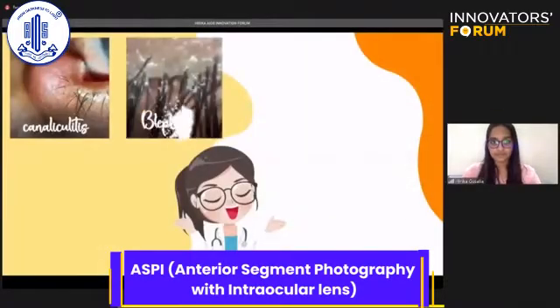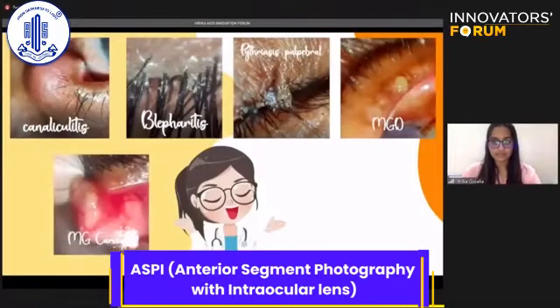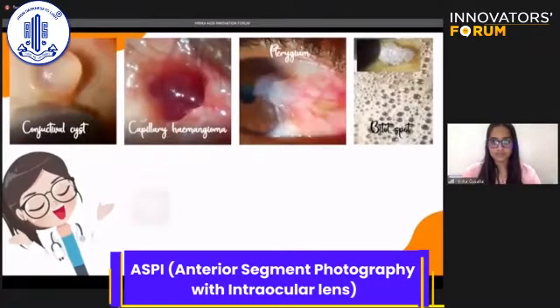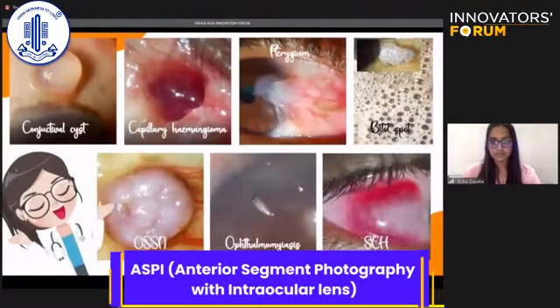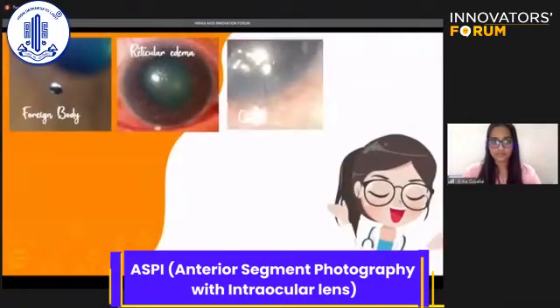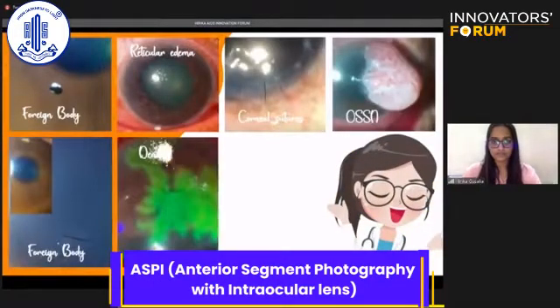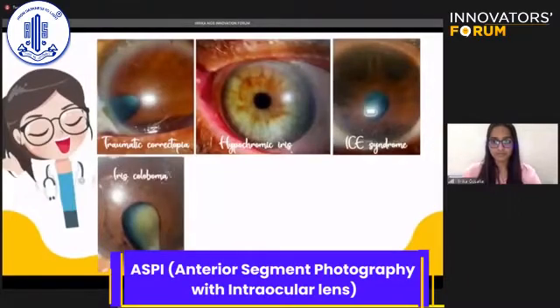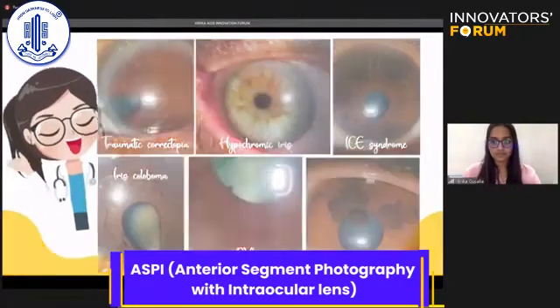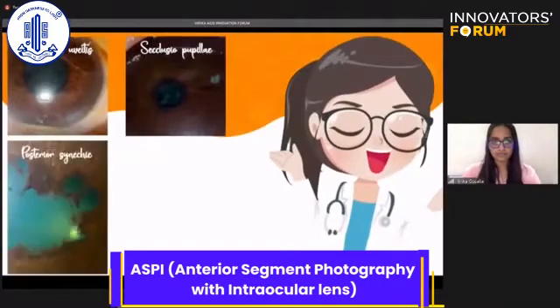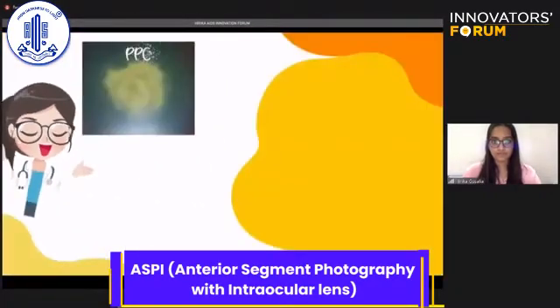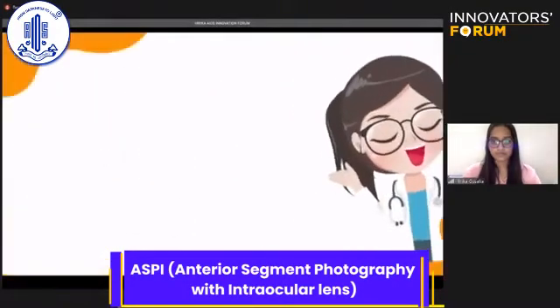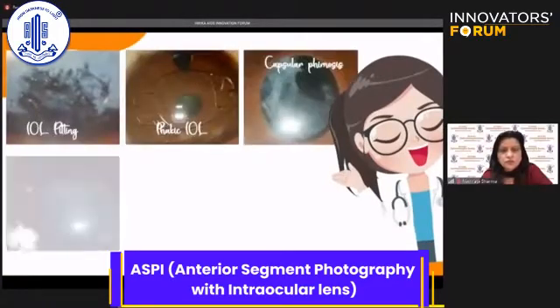These are a few of the lid pathologies, conjunctival findings, cornea-related pathologies, iris-related and nuclear-related problems, uvea-based pathologies, cataract-related findings, and intraocular-related findings and complications.